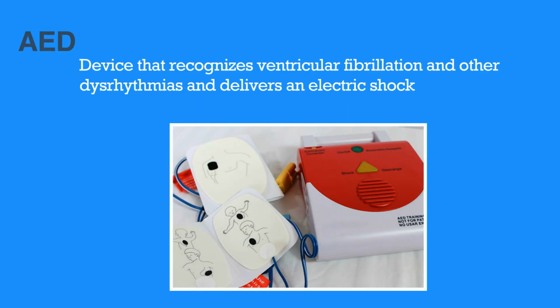An AED, or automated external defibrillator, is a device that recognizes ventricular fibrillation and other dysrhythmias and delivers an electric shock at the right time. The AED is nearly foolproof and will not allow you to make a mistake. It is safe for anyone to use. Now, let's review the AED steps.